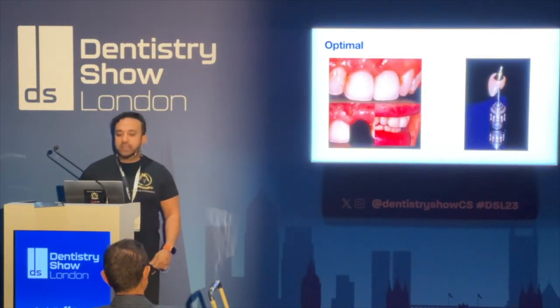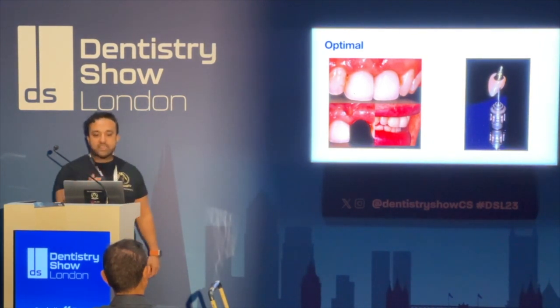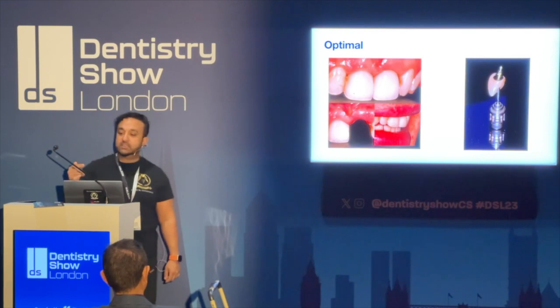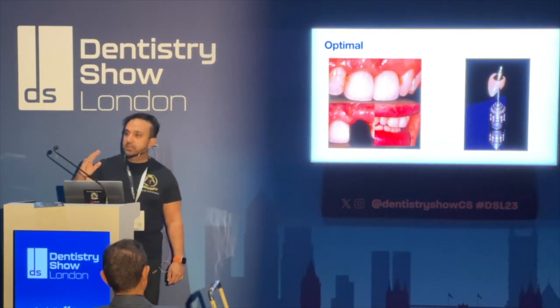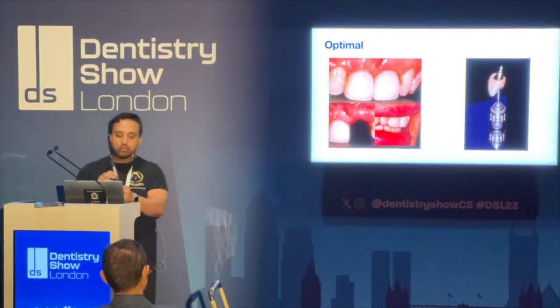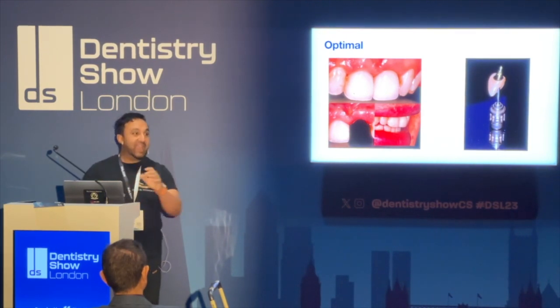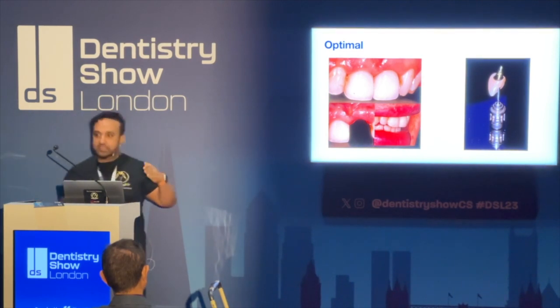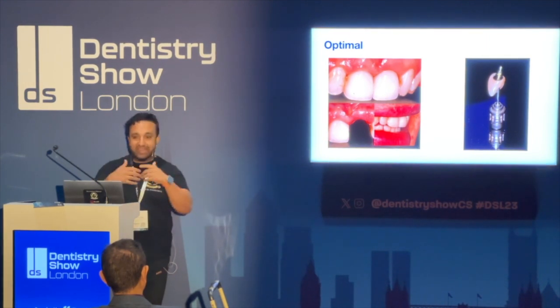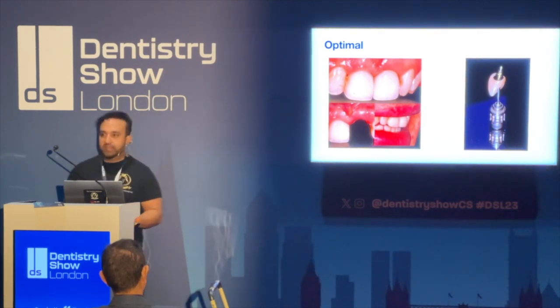There's new technology coming that we are able now to use angulated screws. This was really exciting. This is the central incisor that I did on the left-hand side, and as you can see, I've got the driver in through the palatal, but the maxillary angle was high, so it's not a direct drive. So the screw they've designed now is on almost like a round ball head, and it goes into the actual screw, and you can tighten it that way at an angle, as opposed to using the hex that's just straight. Major advantage for having screw-retained prostheses at the front of people's mouths, negating the risk of cementitis and the risk of anything like that.